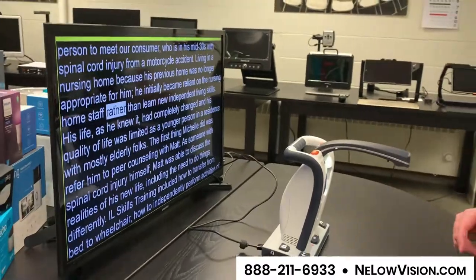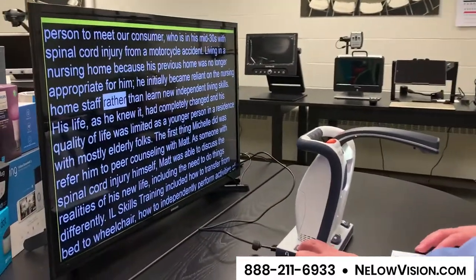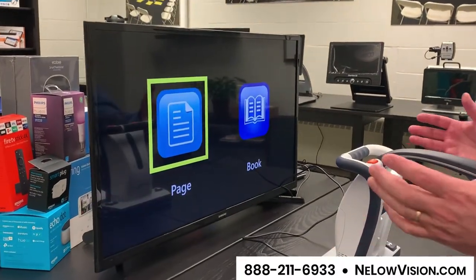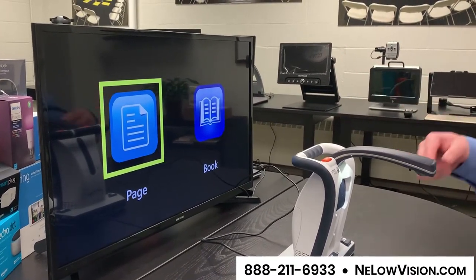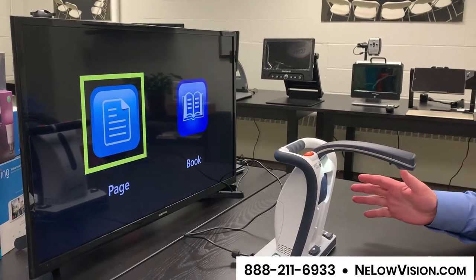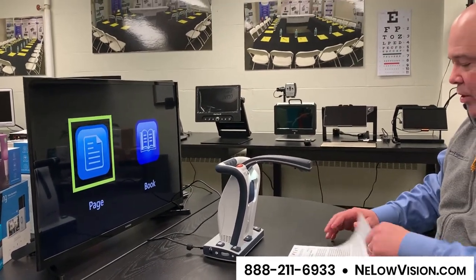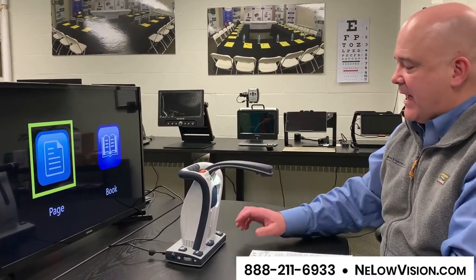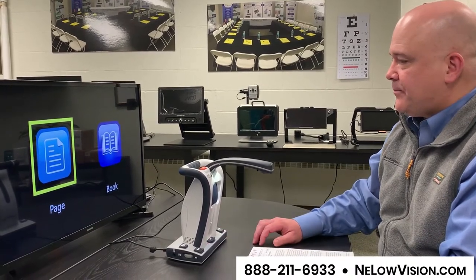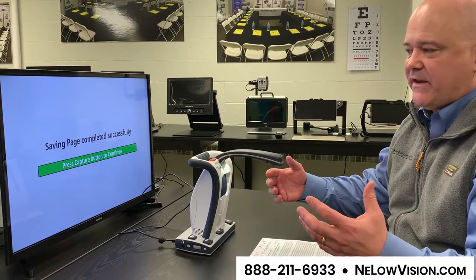You can also save documents on this device. I'm going to press the save button and hold it for about three seconds. It asks: page or book mode — meaning, do you want to save just this page, or a whole book? You can save books onto it. Most people are just reading one document at a time because it's so simple, but if you wanted to scan in a whole pamphlet or newsletter and read it later, you can do that too. We're just going to save a page. I hit the select button and it announces: 'Saving in progress... Saving page completed successfully. Press capture button to continue.' I like that it announces all the different voice prompts.